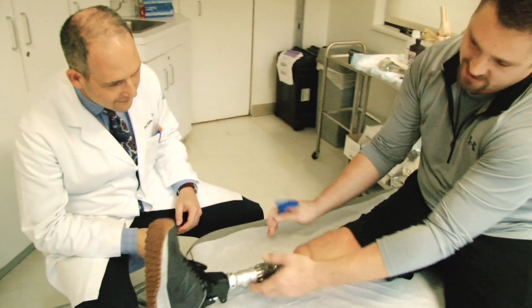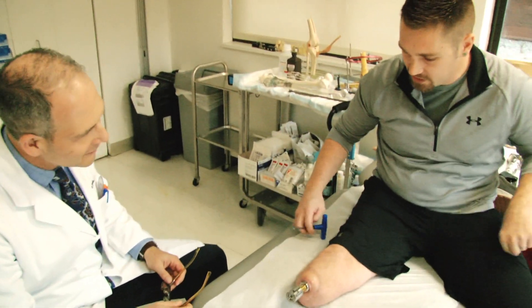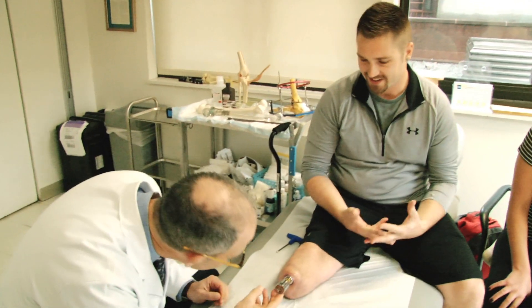I've been walking with no pain. I love how easy it is — just take it on, take it off. Seconds.